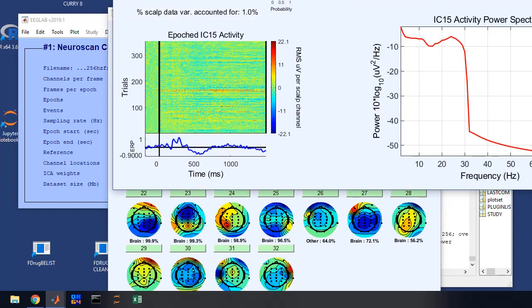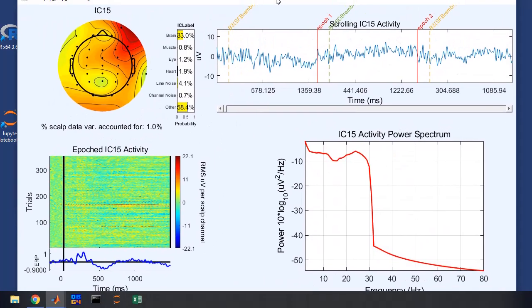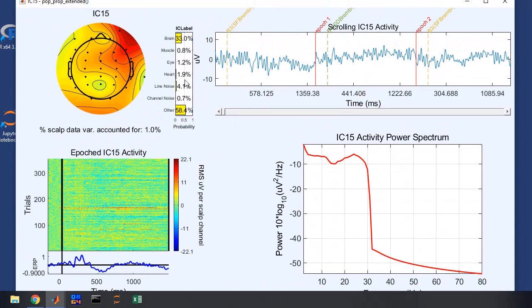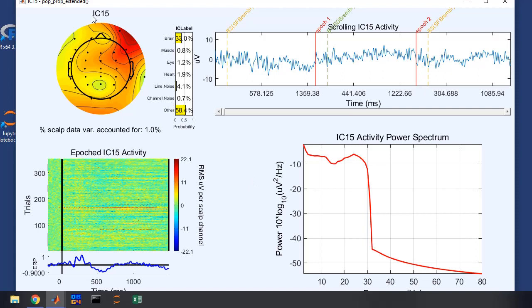So I'm going to pull out 15 and we'll take a look at 15. 15 is also being, it's a little split between brain and other, but you can see where it's localizing here out on the ocular electrodes. So the other thing I want to point out to you is that the further you get with our component, so this is component 15, you can see that the percent of scalp data variance accounted for is only 1%. So it's only 1% of the data and that continues.